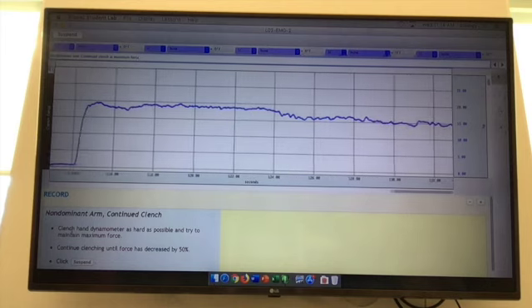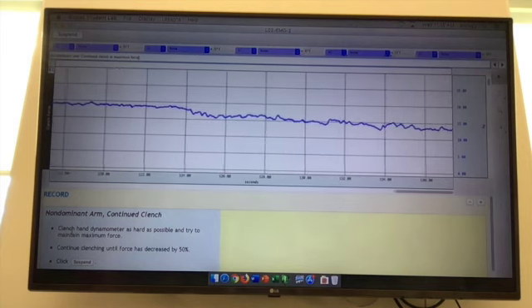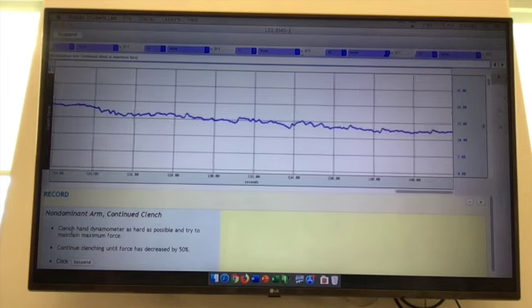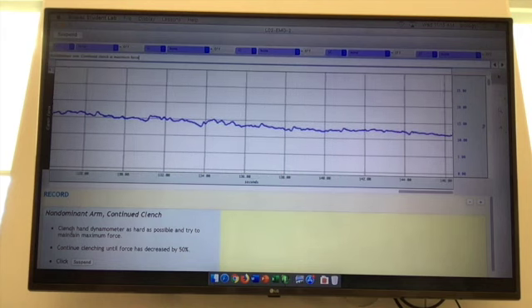Notice how much faster my non-dominant is going down here. I don't have as much stamina. We'll be able to compare this data afterwards, but you can clearly see decreasing quite a bit faster. And they started just over 20, so we'll wait until they're down around 10.